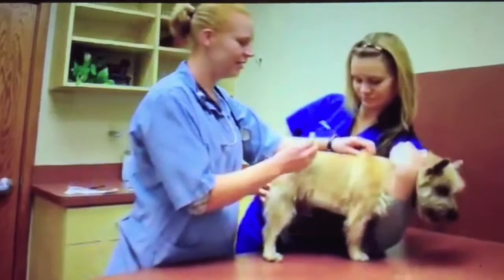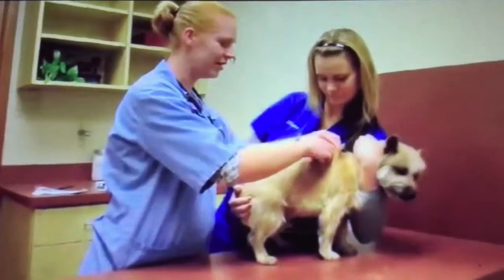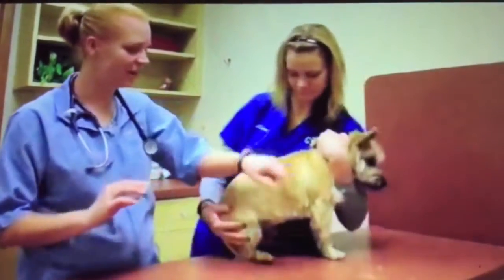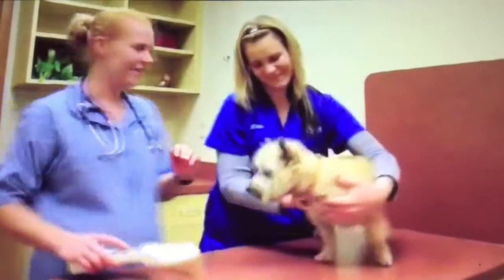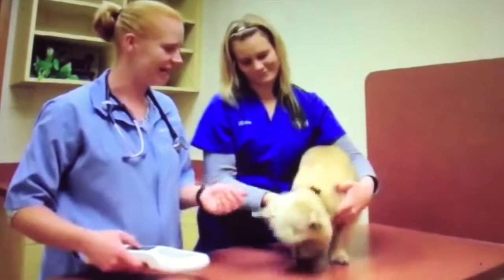Oops. So we're just gonna place the needle under his skin, a little flinch there, and then pop the microchip in. That's it. He wants the rest of his treat. Here's your treat. Obviously Bowser, he felt the prick of the needle for a second, but then he was more interested in the treat than anything else.